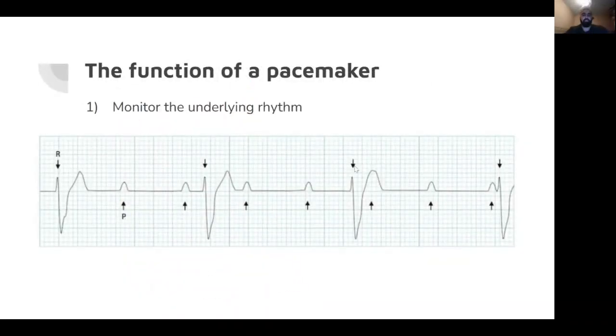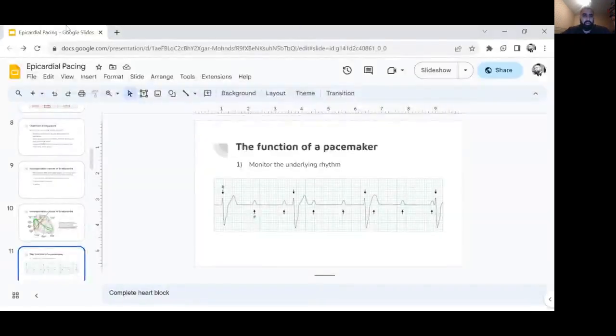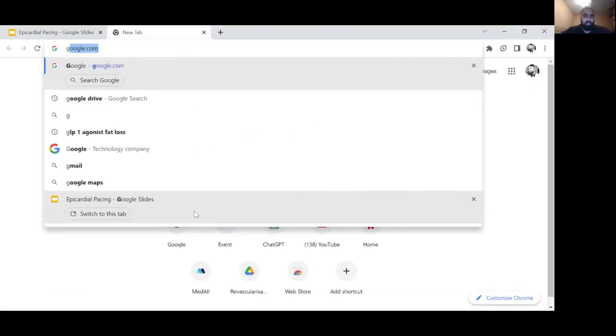So here, if we just use this as an example slide. If you set the pacing box, one of the settings on the pacing box is the voltage output. Let me just get an image of that.